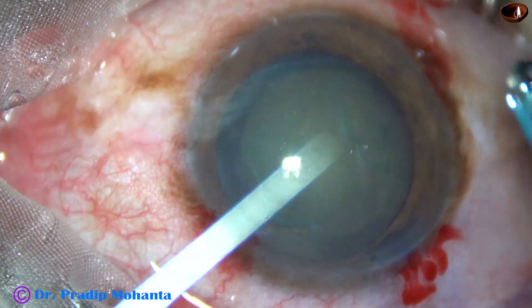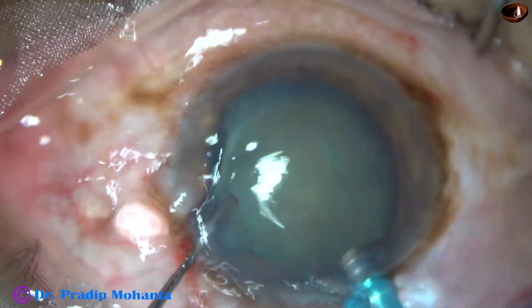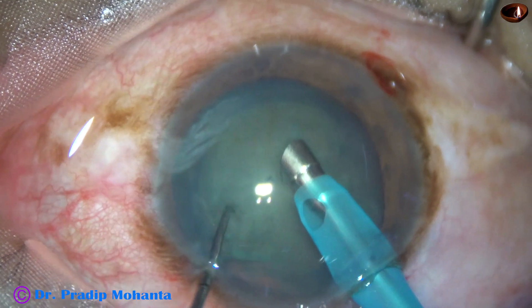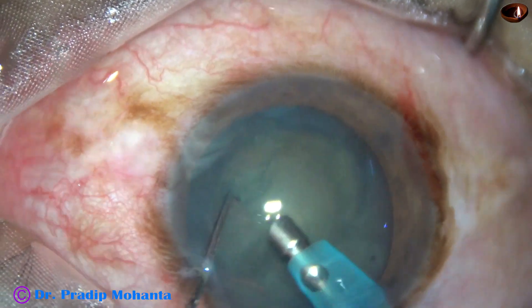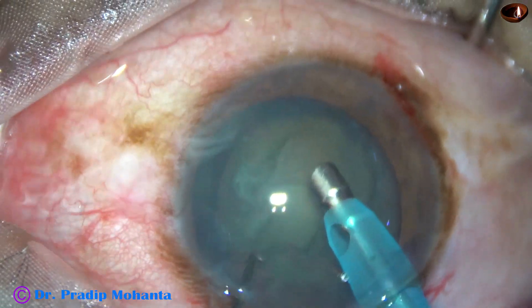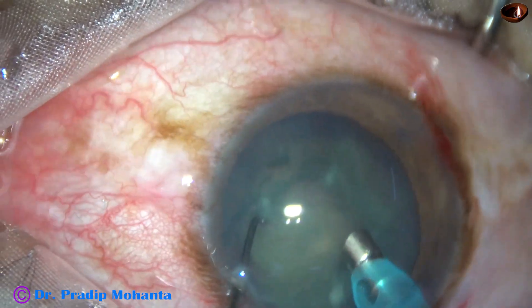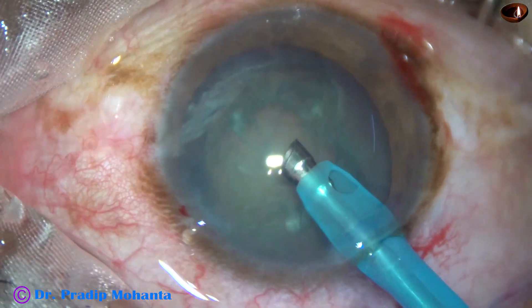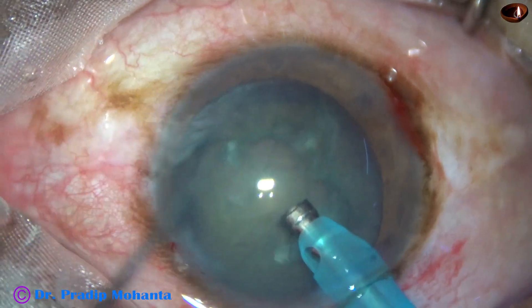Let us note how much time we take for nucleus management. At 2 minutes 15 seconds the phaco handpiece goes in. After aspirating some superficial cortical lens matter, the nucleus is rotated both clockwise and anticlockwise. The handpiece is then turned to make the bevel up.